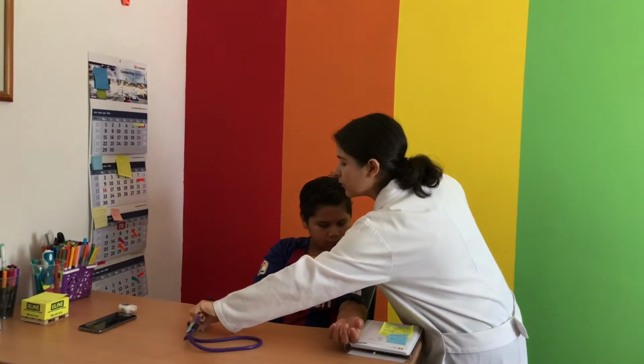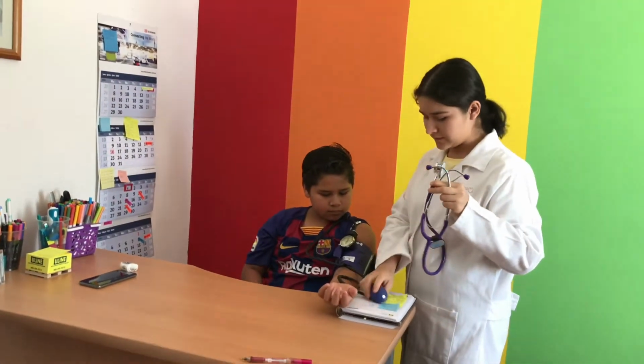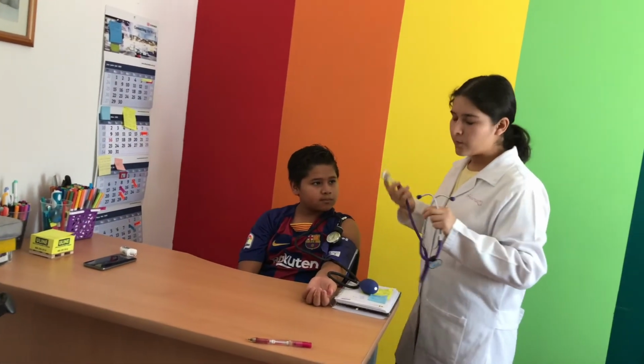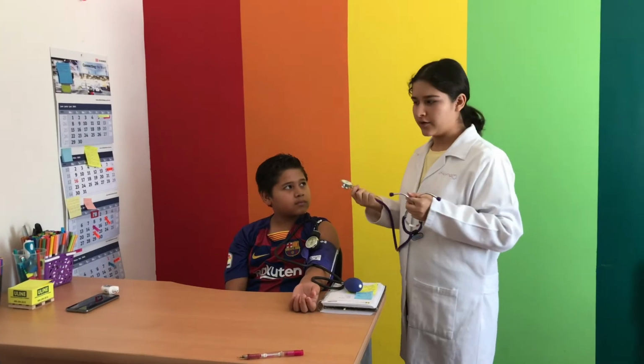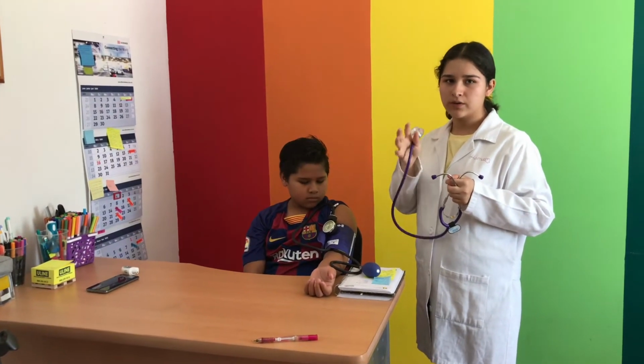Okay, so with the help of the stethoscope, we're gonna put it where the artery is. But for it to be a lot easier and more accurate, I'm gonna ask the patient also to mention when he feels the first pulse and the last one.